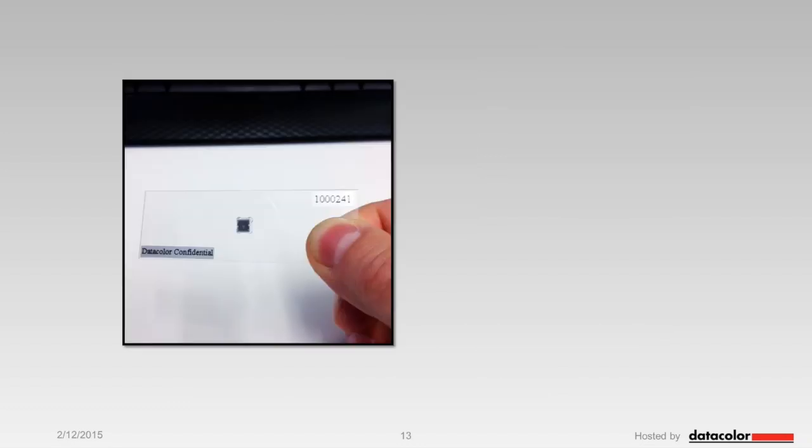So what you can see on this next slide is actually a prototype of a glass calibration slide. I have to add that the initial model was the chip was printed on an alloyed metal, so it's black, and that was originally developed for microscopes. We tested that too, but the scanner had problems focusing on that particular slide model.